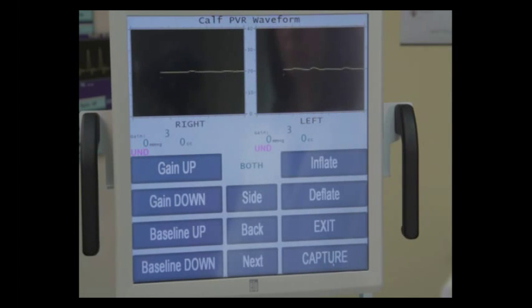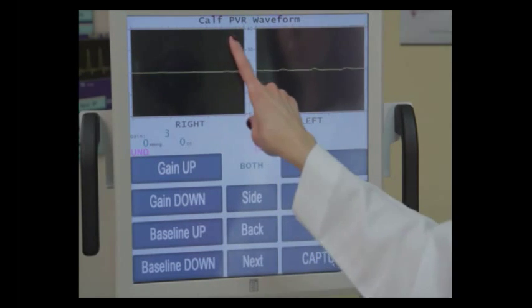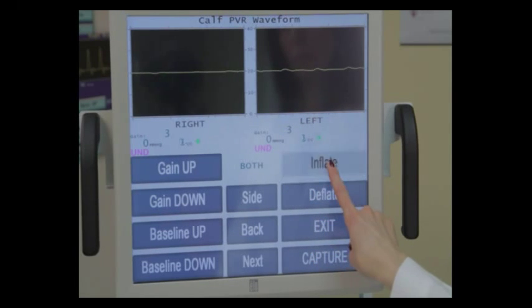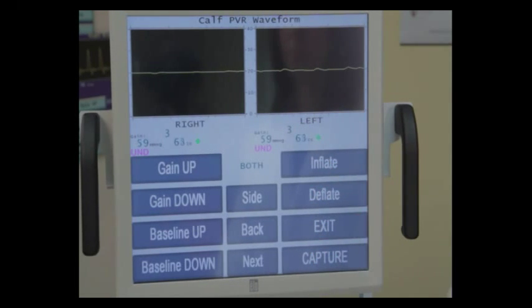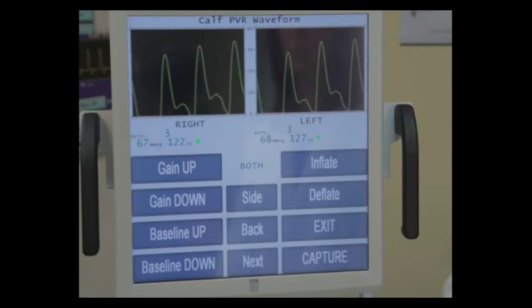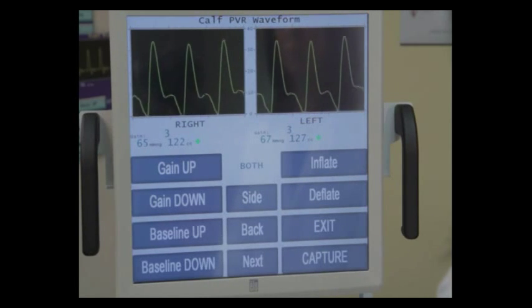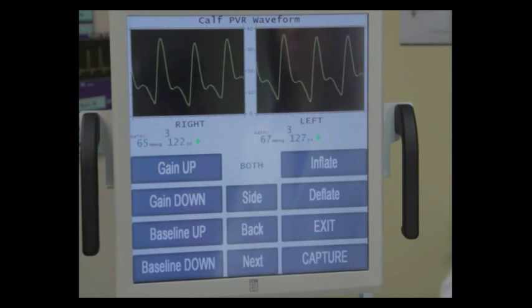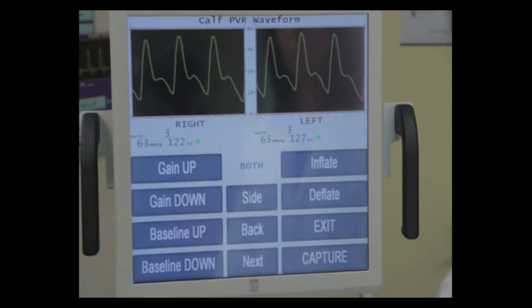We now see the instrument is asking us for a calf PVR waveform. Again, we're going to simply press the inflate button one time, and the pumps will automatically inflate the cuff to 65 millimeters of mercury. If the cuff is above 68 millimeters of mercury, a little OVR signal will appear under the pressure, and if it goes below 62, an UND sign will flash. Anything between 62 and 68 is acceptable.